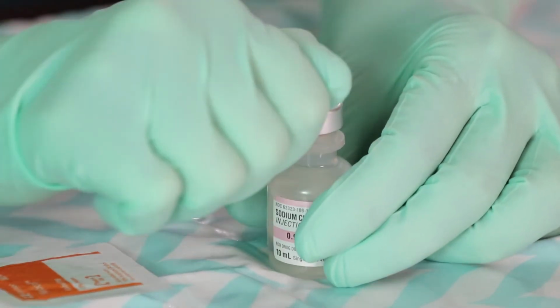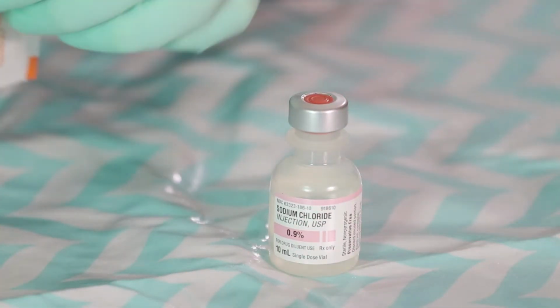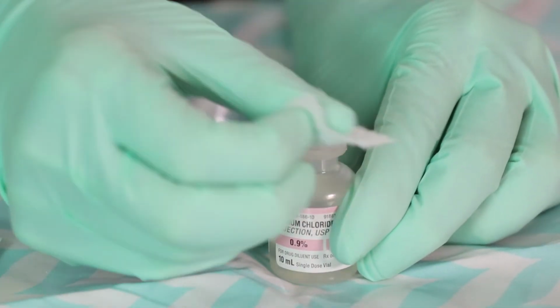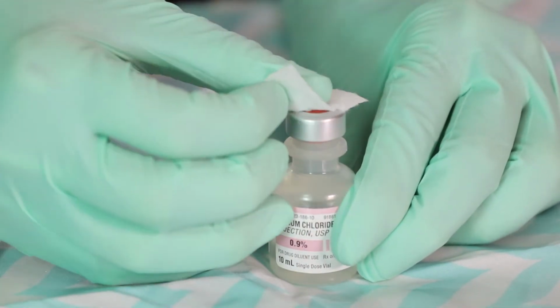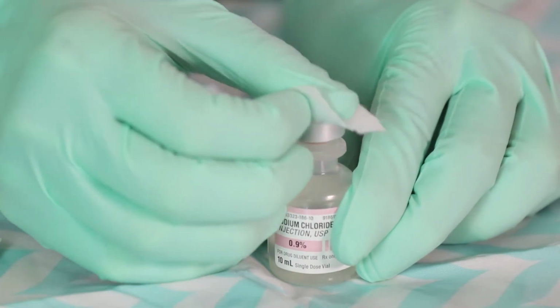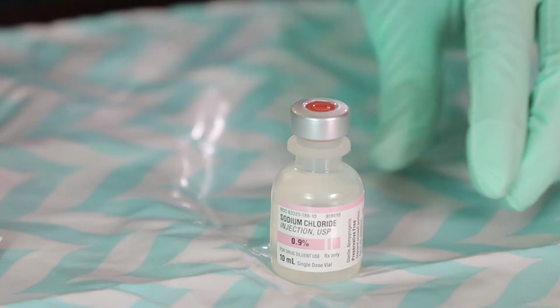Swab each vial top using a new alcohol swab. Apply friction in one direction to scrub the vial top. Swab for 15 seconds, or at least 10 long, firm strokes. Allow the vial top to dry before accessing.